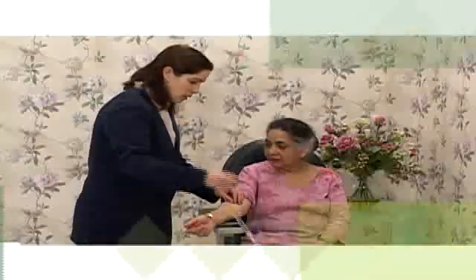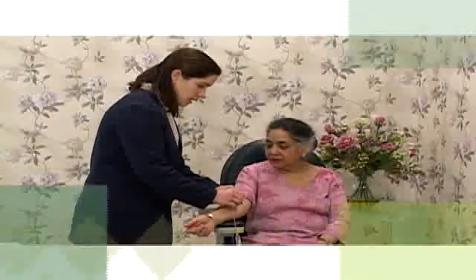An intravenous will be inserted into your arm, and then the Cardiolite radioisotope will be injected into your bloodstream. The Cardiolite is carried by the blood to your heart muscle.